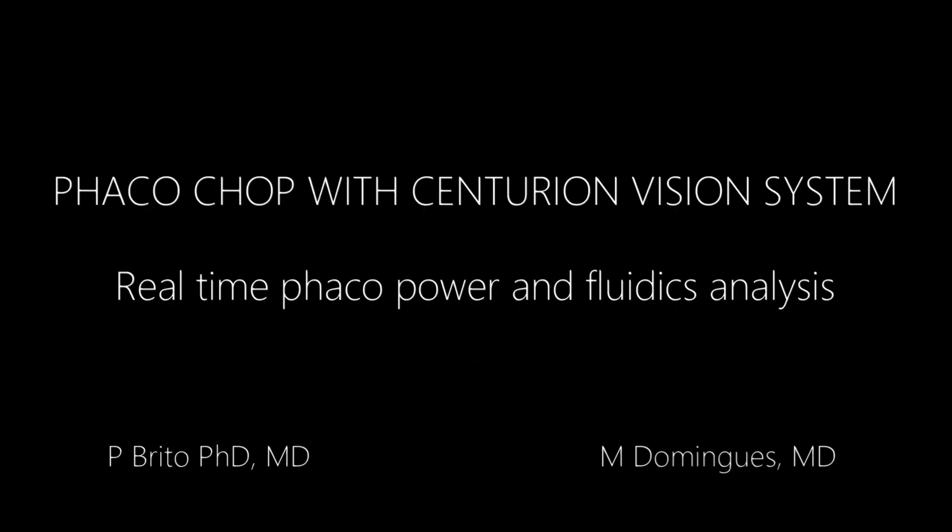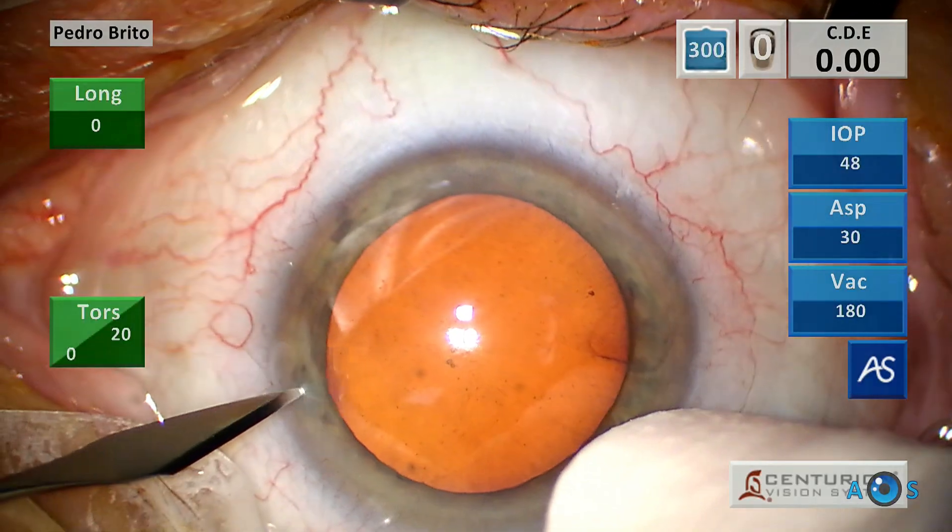In this video, cataract surgery is performed by FACO Chop Technique, using the Centurion Vision System.